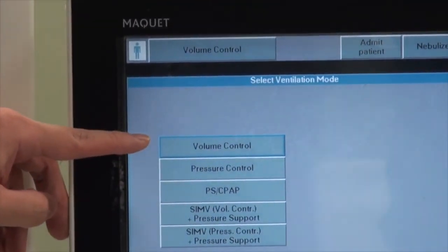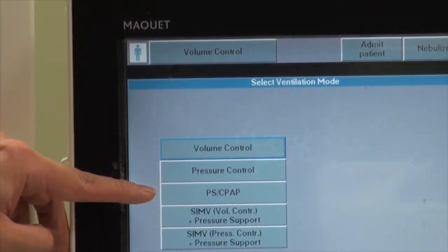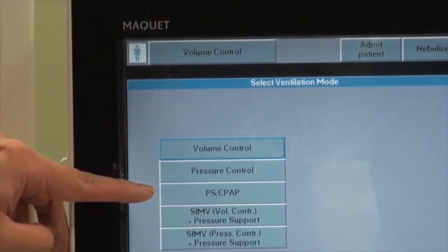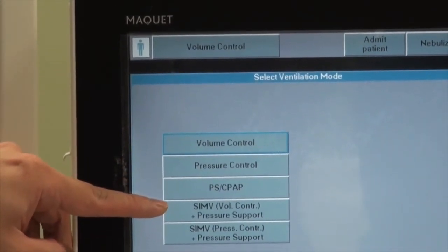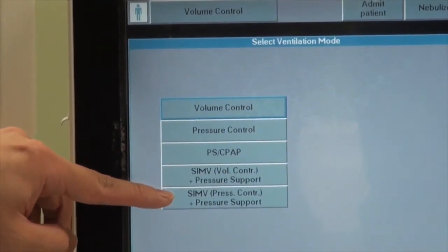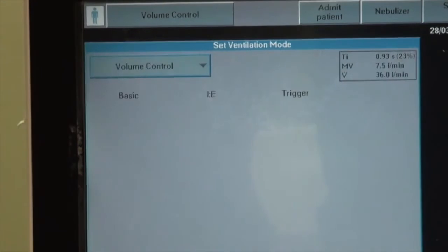For this machine, the available modes are volume control, pressure control, PS/CPAP — which is the pressure support equivalent on other ventilators — as well as SIMV in either volume or pressure control. For this particular example, we will be using volume control.